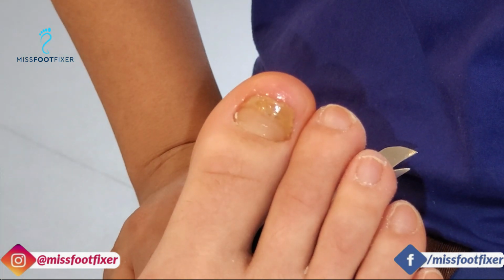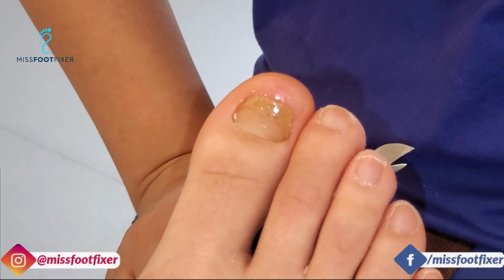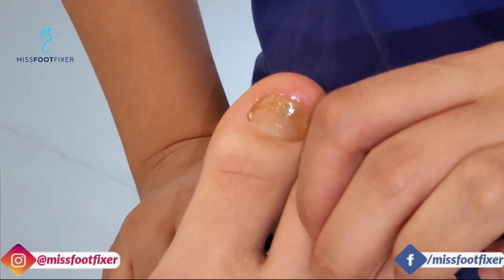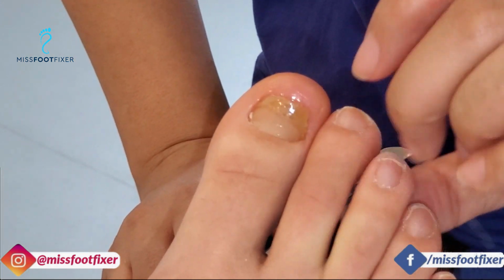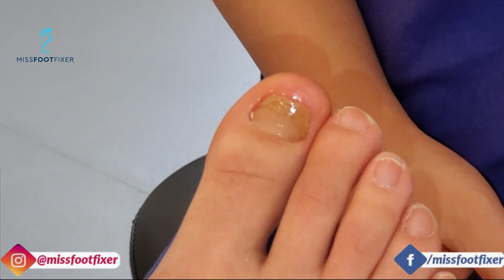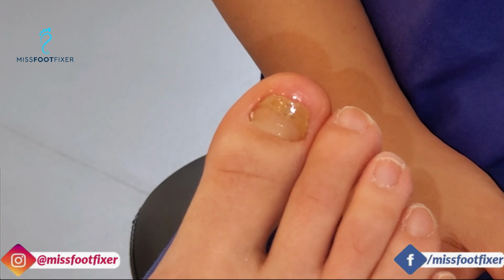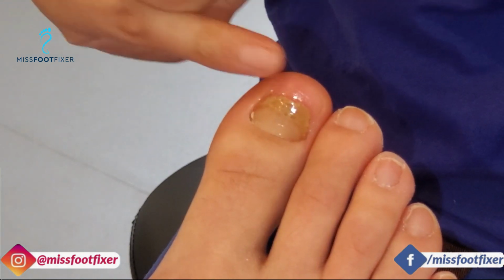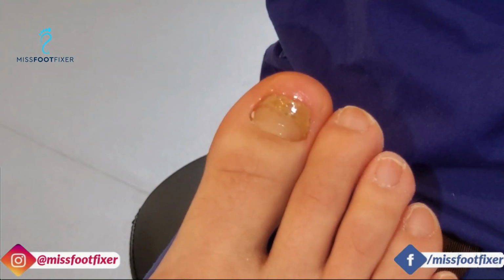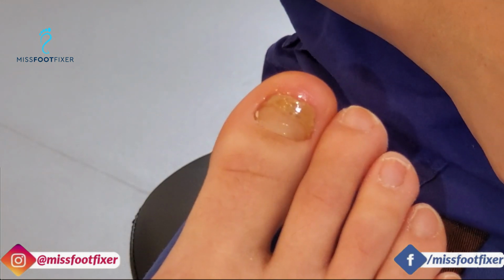We're going to do a polygel, which is a gel that we use on patients who have traumatic nails or fungal nail. So this patient has had this traumatic nail for about 10 years and she's coming in to do some polygel. First of all, what we're going to do is reduce the nail down so that we can see what's on the base, clear it out, and then we will apply the gel. Alright, then let's get started.